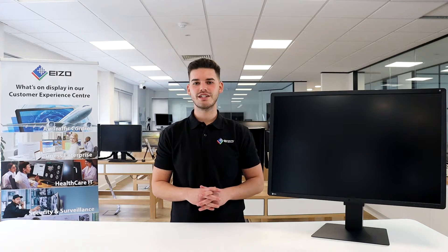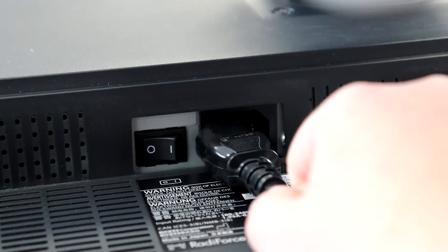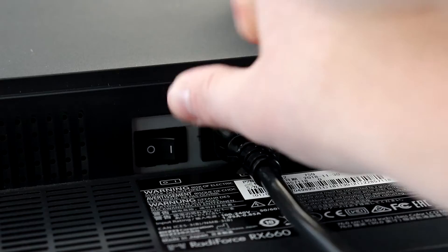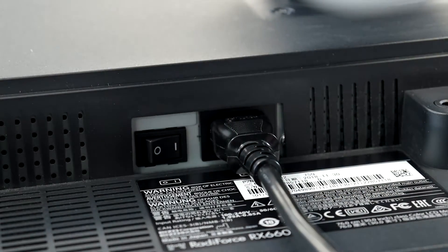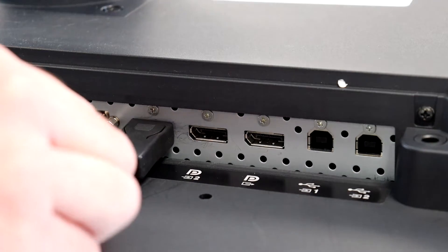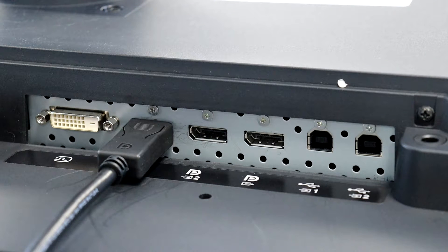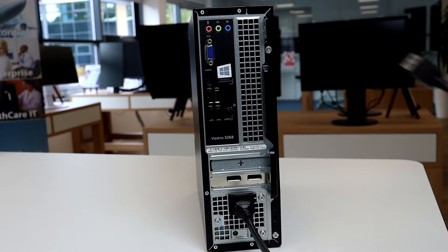Connecting the RX 660 to your workstation couldn't be more simple. Firstly, ensure the power cord is connected and that the rocker switch is in the on position. The RX 660 is able to connect to your workstation using just one single cable. Connect one end of the DisplayPort cable to the DisplayPort 1 input and the other end into your workstation.